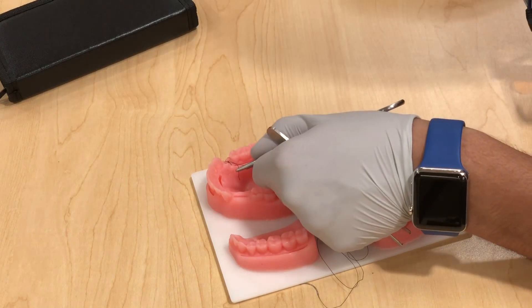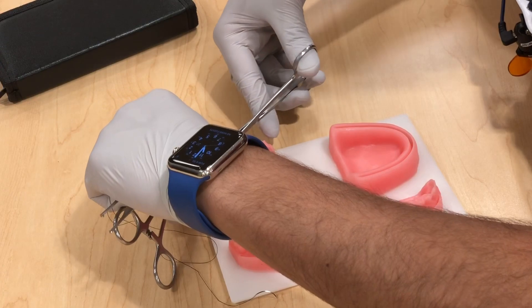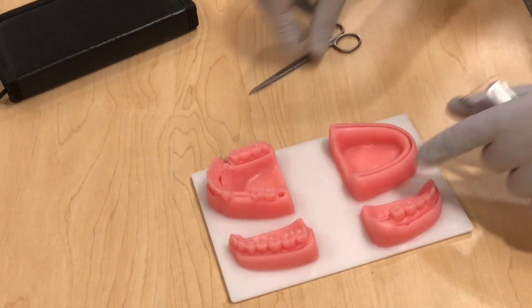Release your scissors, and remember you want to position them more toward the buccal and cut 2 to 3 millimeters. That's it — there you have it.